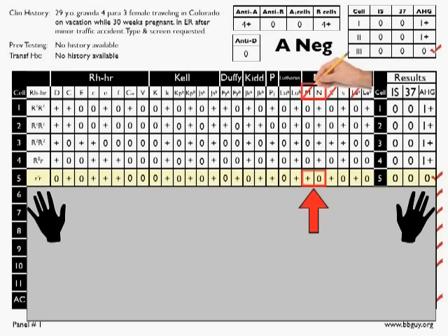So in the Lutheran system, we've got double dose expression of Lutheran B, single slash through Lutheran B. In the P system, there's only one antigen on the panel, that's P1. It's present, there's no reaction, we put a slash. The Kidd system, we have double dose expression of JKB, so single slash through JKB. Duffy system, double dose expression of Duffy B, so we put a single slash through FYB.